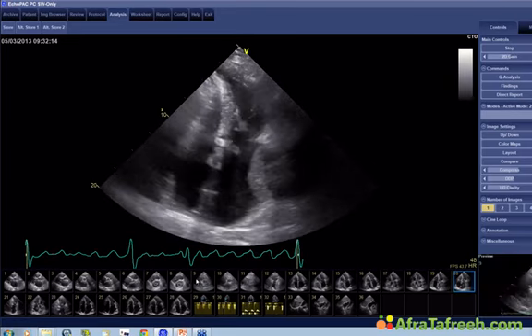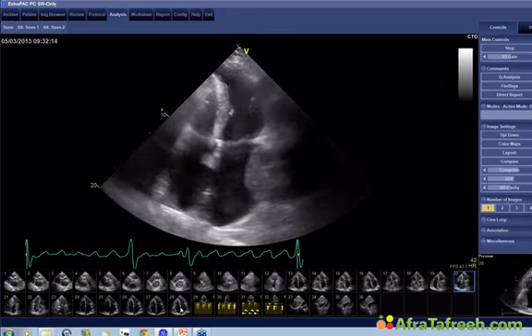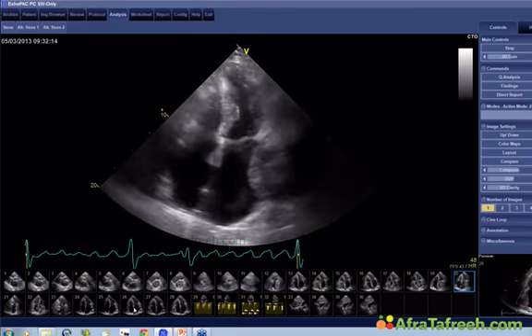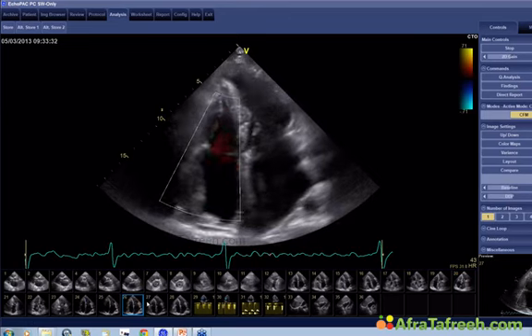But I want to know from you, what do you think the patient has? What is her underlying pathology? She had only mild hypertension, severe dyspnea, atrial fibrillation.